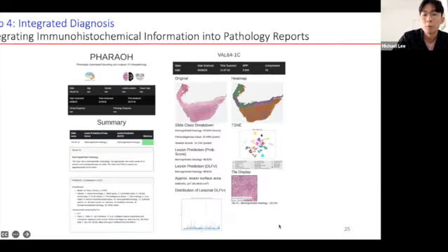And this is a more recent one with all the classification results, the heat maps, as well as the class breakdown, and some other things that our other colleagues have been working on, such as deep learning features using unsupervised learning, etc. And so by doing this, we think that this can perhaps be used as a quality assurance tool, educational tool in the future in pathology.